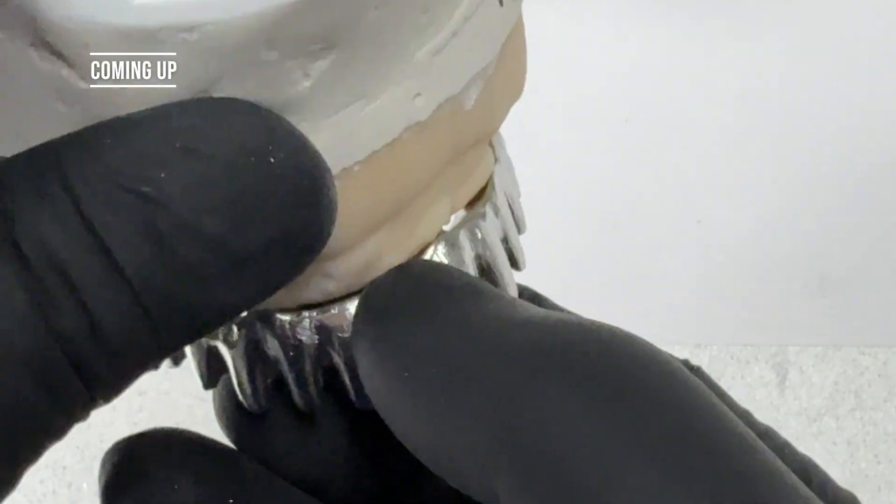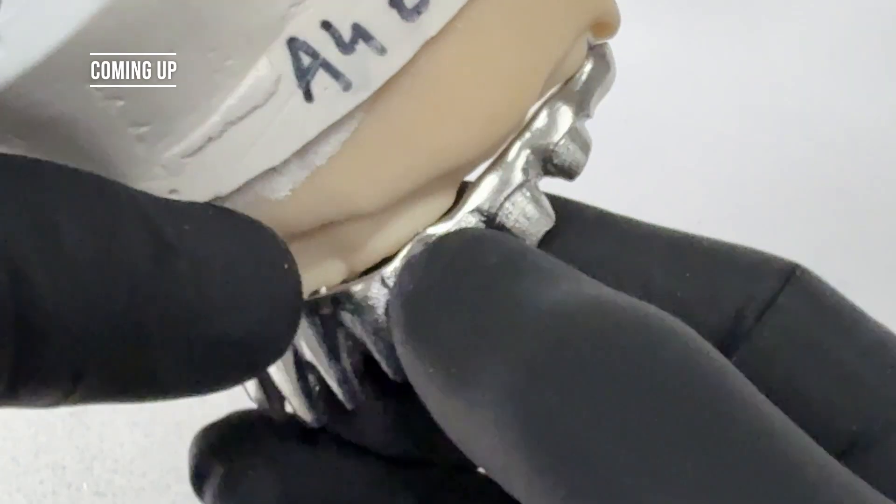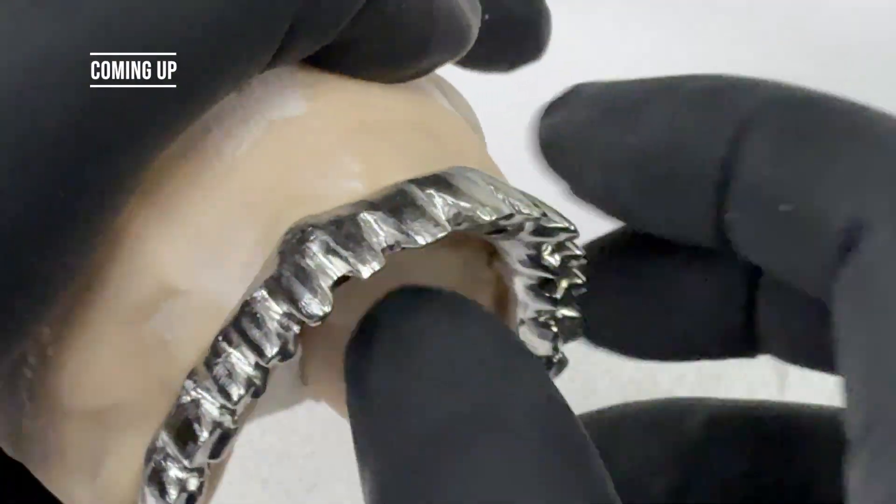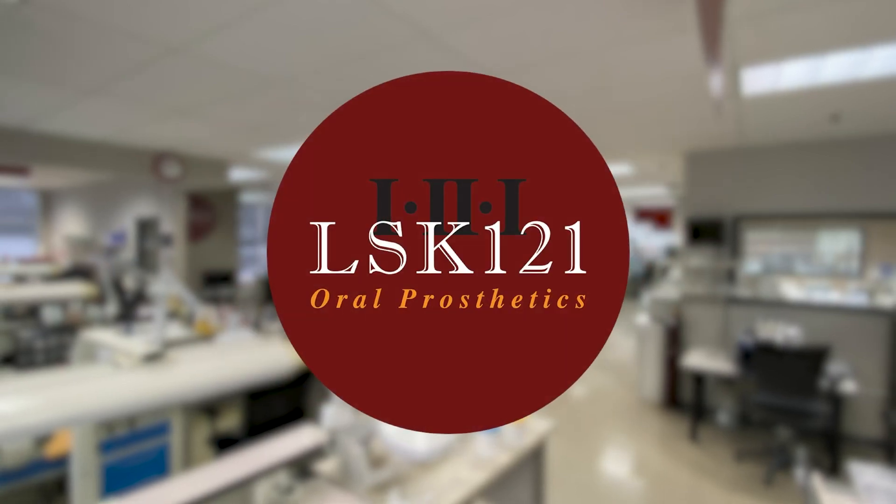Then after I trim it, I can show you guys how much to make this really cool stuff. So I show them a lot of our grinding stuff.